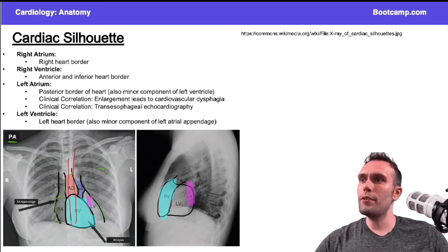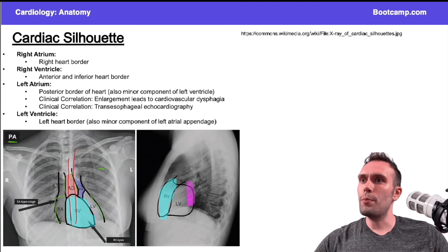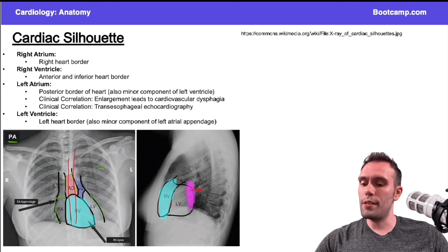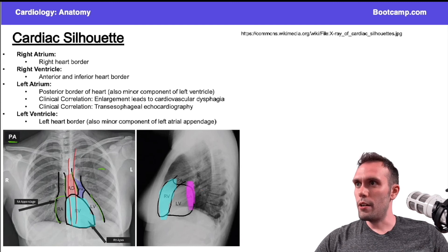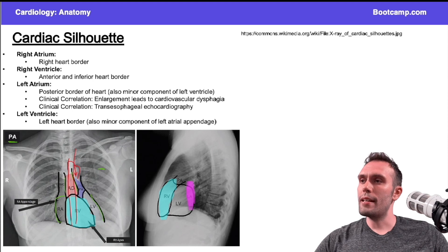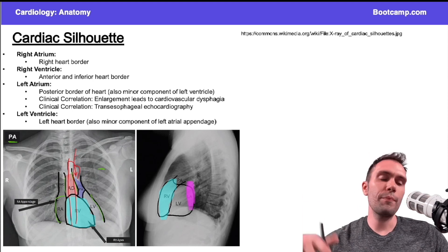If you look at the back of the heart, posteriorly we have the left atrium — very difficult to see on the PA view, but on the lateral view you can clearly see the left atrium. When it enlarges, it can push onto the esophagus. Also visible here is the aortic knob, which is essentially the distal aortic arch, curving posterolaterally as it forms the descending aorta.